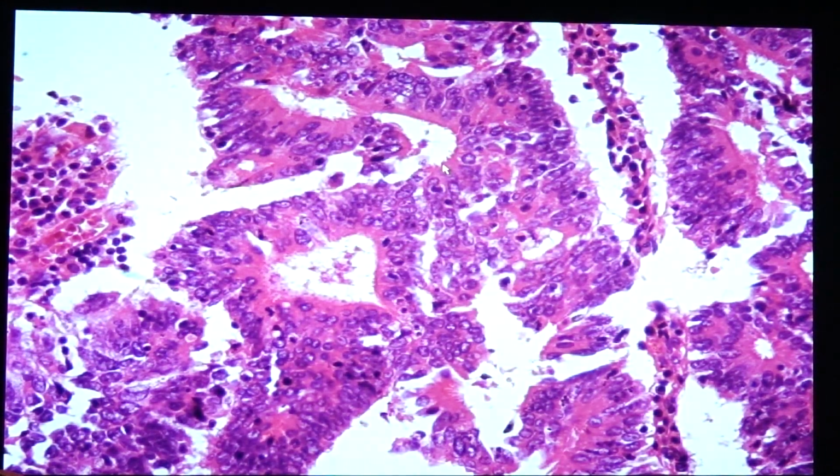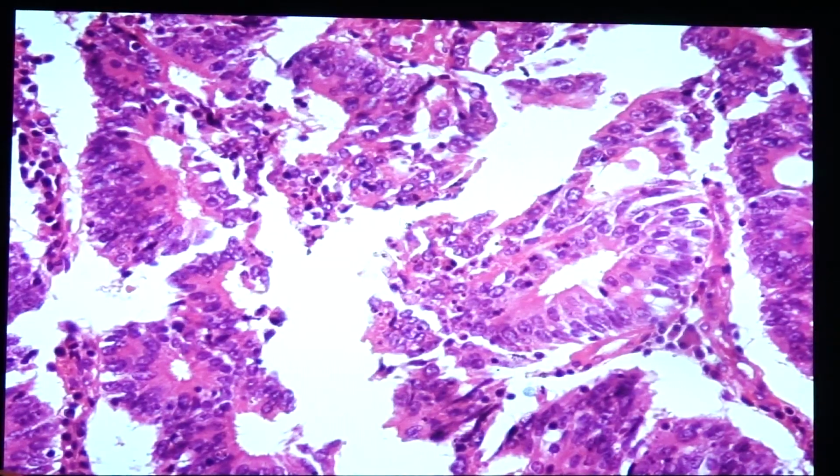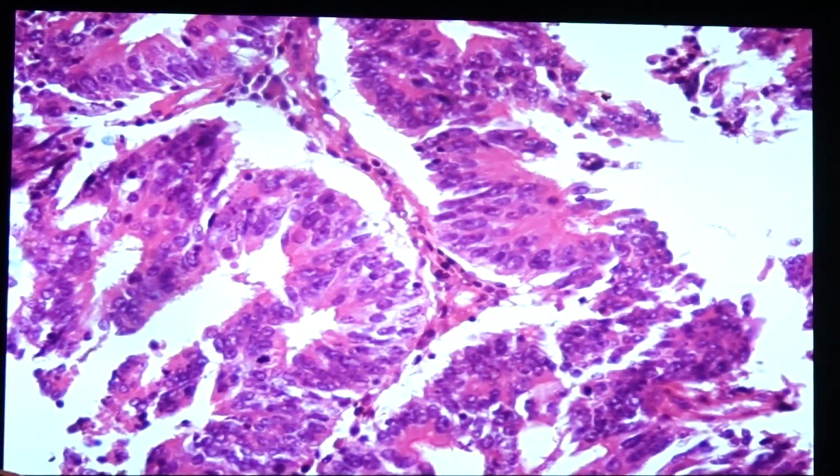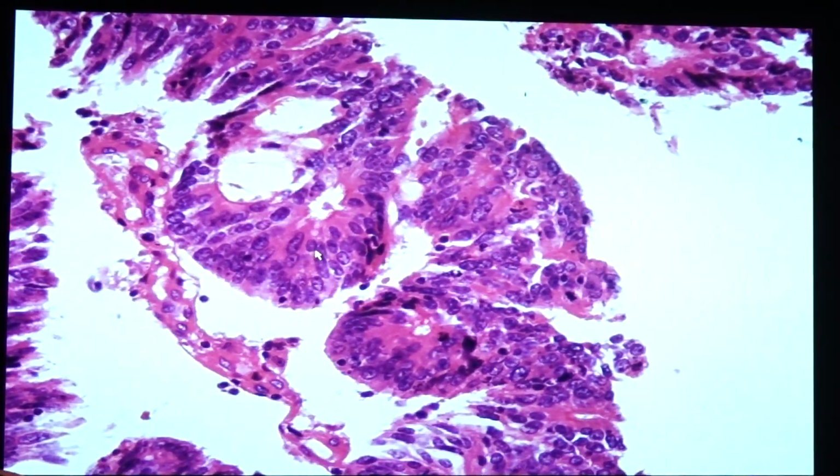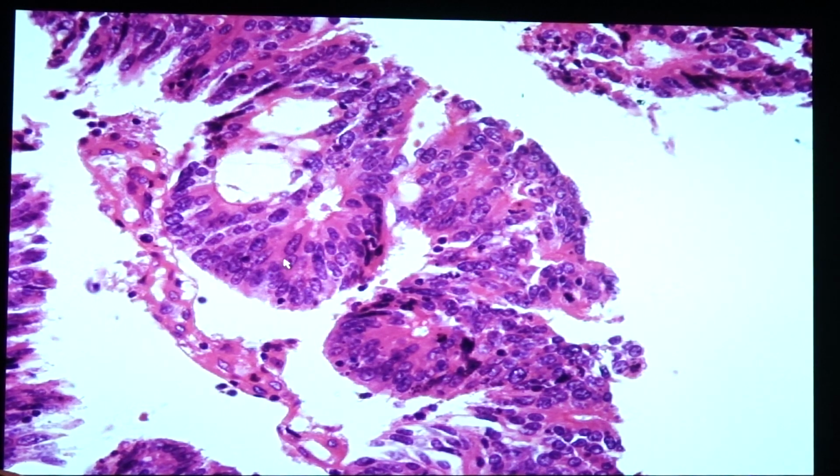So here you would see the presence of the atypical glands, okay, presence of pleomorphism. They're seen in back-to-back pattern with no intervening stroma. Okay, so you see the very little intervening stroma. You would see the presence of nucleolus. Okay, so our last slide for today is slide 48.